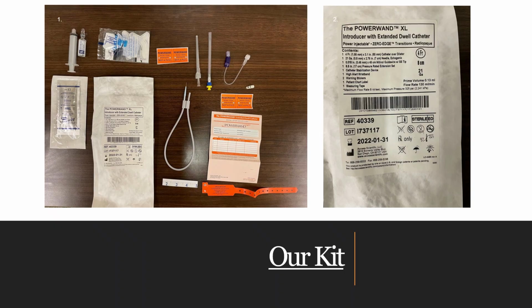So this is the product that we had available to us when we were setting this whole curriculum up for our residents at our program. It's the PowerWand XL. This is how the package looks before you open it up. This is just the contents spread out. There are a lot of different manufacturers for different midlines, so the products available to you in your area may vary widely from this. Big picture takeaway from this one, this particular catheter is not trimmable.